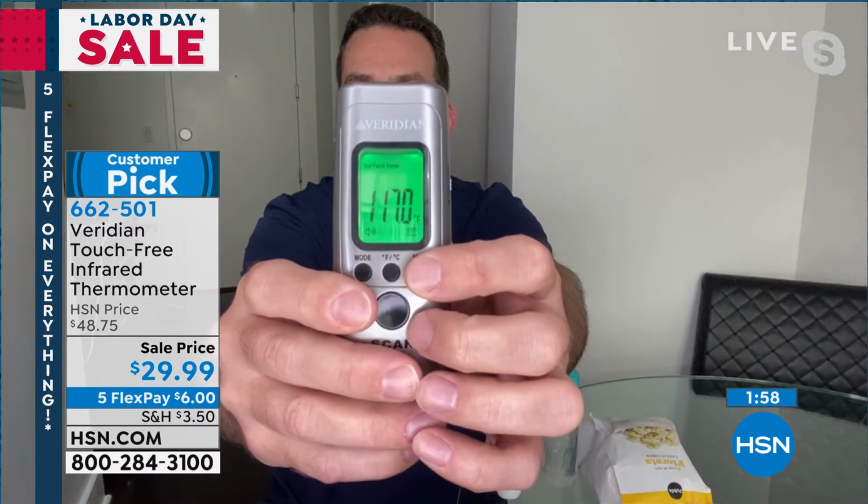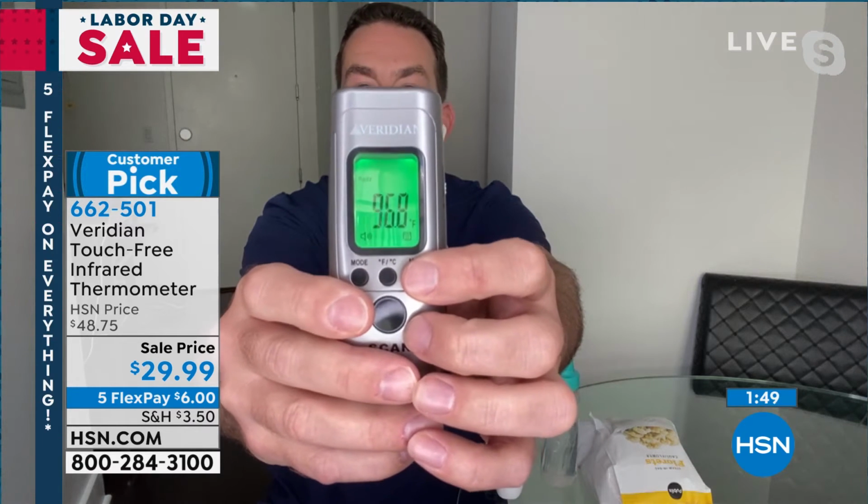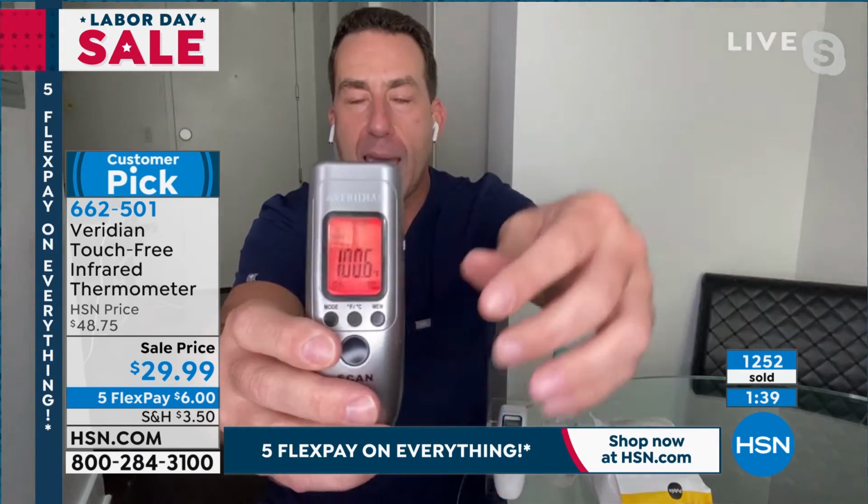It's 97.5. If I'm working with my doctor, Helen, and I want to do telehealth visits and say, hey, doc, I was 97.5, well, that's not my temperature. That's the baby formula. So let's go to one of mine here. So let me scroll, 96.8. It's green, so I know I'm within normal limits, right? So all I have to do is look for that color. Yellow means I'm on the fence. I have that low-grade fever. And again, the red means that I have a fever.